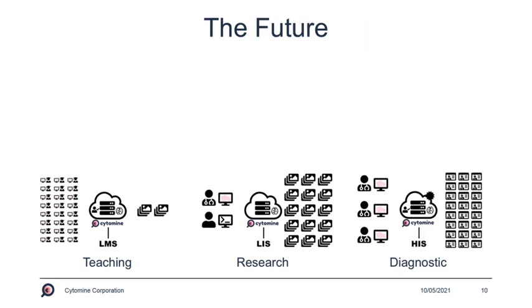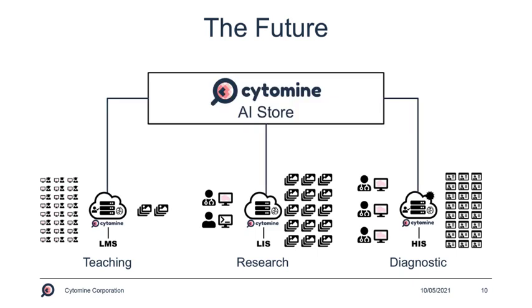But the real future of Cytomine is to provide validated AI dedicated to all these sectors in a centralized Cytomine AI store. This AI store will deliver AI developed by our teams, but also by validated partners.